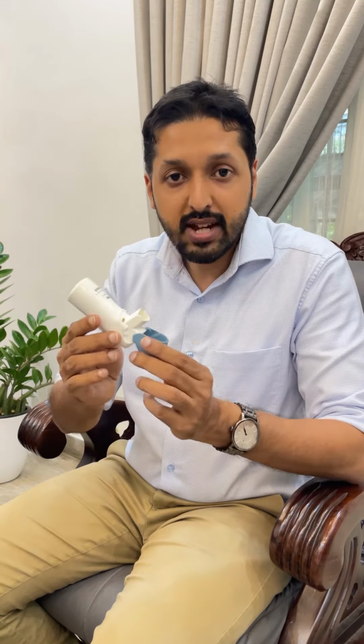How to use the breath actuated metered dose inhaler? You ask the patient to exhale. Take a slow and deep inspiration. Hold the breath for 10 seconds and then exhale. You should know that this device synchronizes with your breath. And for the second puff, you ask the patient to close the cap and then open it and take the breath in the same way.